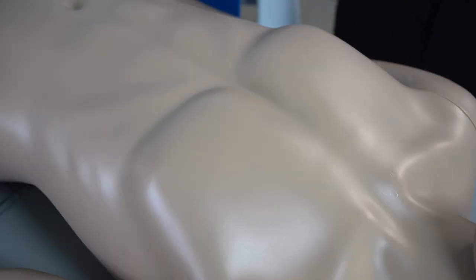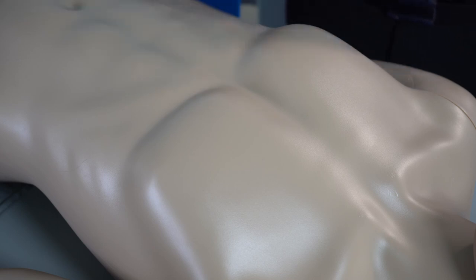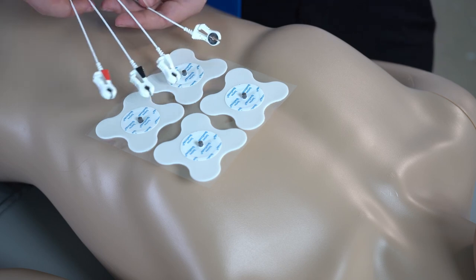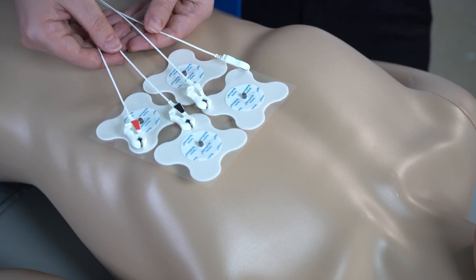Apply the skin gel to the patient's chest liberally, wiping away any excess with a clean gauze pad. This can turn the skin pink, so don't worry. Make sure you clear away any dead skin cells so you're applying quadrodes straight onto clean skin. Do not use alcohol wipes to remove excess as they can dry out the skin and reduce conductivity. Use the line between each nipple as a guide for placing your quadrodes. Remember that all quadrodes will be placed towards the left-hand side of the body. The top two CV quadrodes are placed just above the nipple line, and the bottom two are placed below, underneath the breast tissue. It is vital that ECG cables do not cross over when applied, as they can create conductive loops that heat up and cause burns.